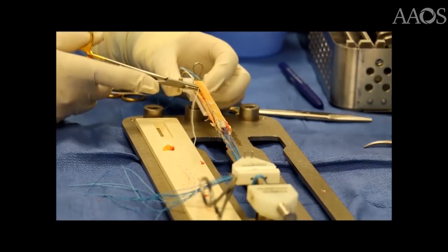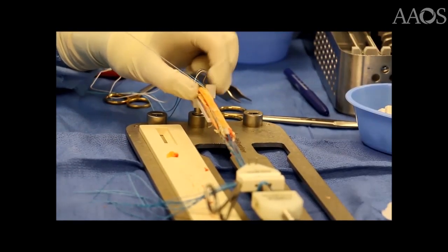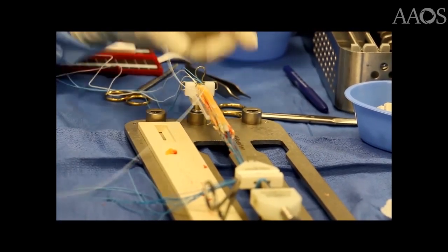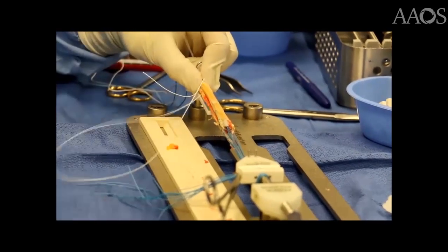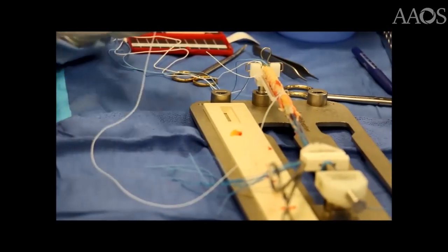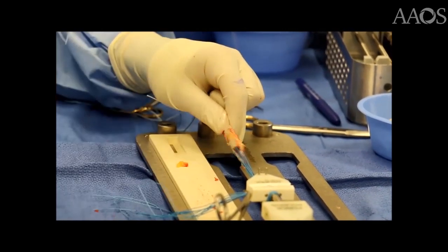Beginning at the looped end of the graft, a braided suture is used to bundle the tendons together. The suture is started between the grafts in the middle so as to place the knot in the middle at the end. The braided suture is run down towards the non-looped end of the graft, stopping several centimeters from the tendon ends, allowing the ends to be separated later for back-up tibial fixation using a large frag bicortical metal screw with washer.